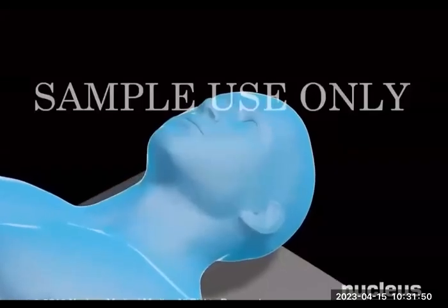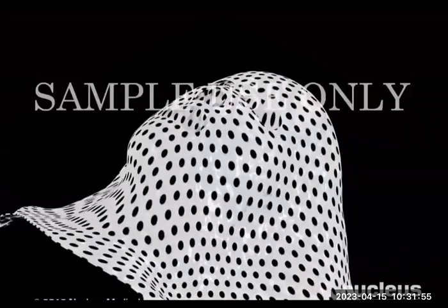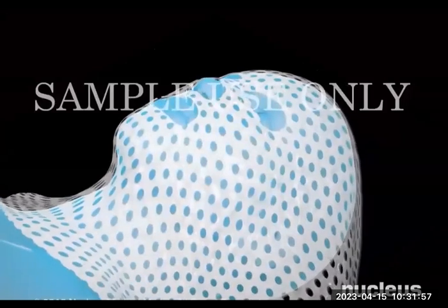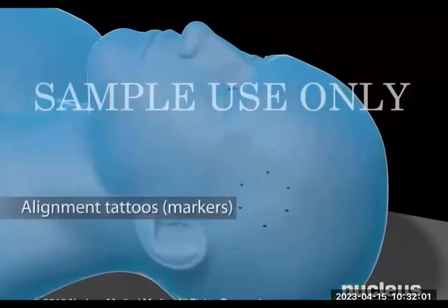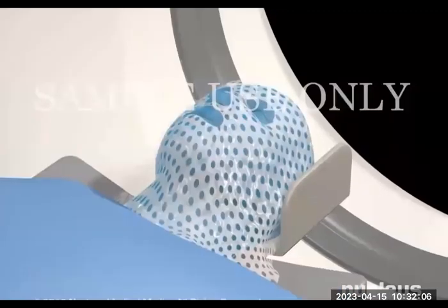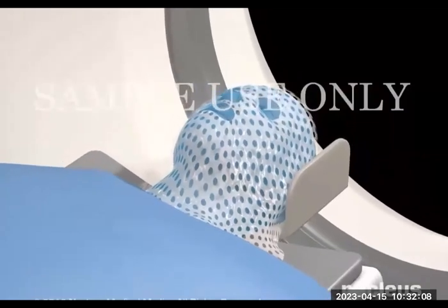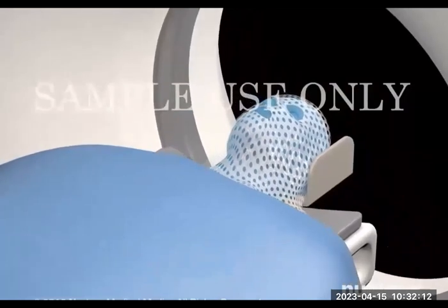If the tumor is in your head, your radiation therapist may make a mesh frame or mask that will keep you positioned correctly during the IMRT. Or you will get small permanent tattoos to help align the IMRT. Next, your therapist will do a CT scan of your head to get a detailed picture of your tumor and its borders.